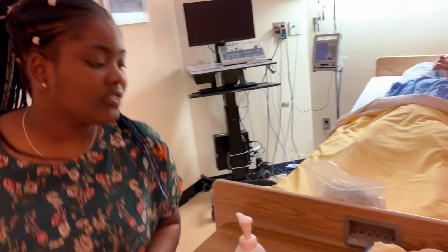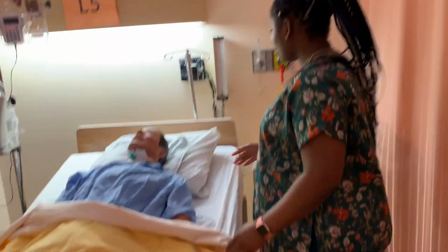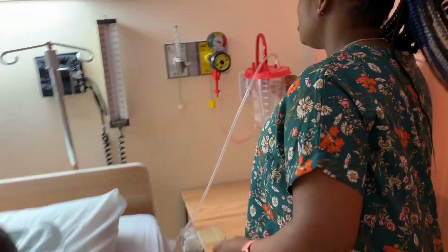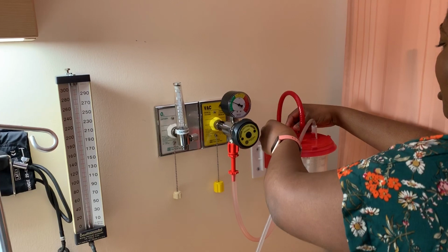And now I'm gonna do my safety check. So my patient is not in distress. Head of bed is up. So now I'm gonna start with my safety check. So I'm gonna make sure the suction is on. So yes, the suction is in the on position.